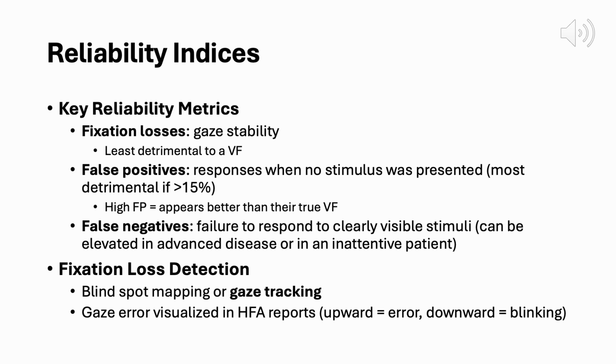False positives occur when a patient responds even though no stimulus was presented. This is the most damaging type of error, especially when the rate exceeds 15%. A field with many false positives may appear better than it actually is.